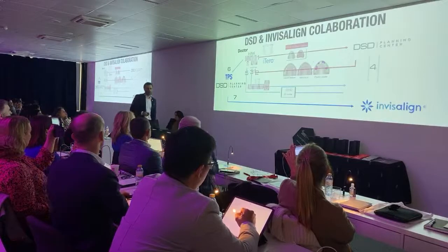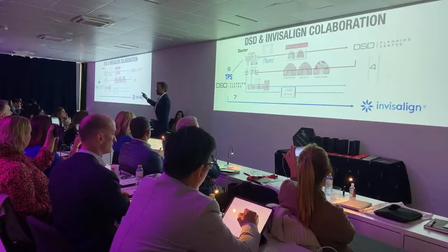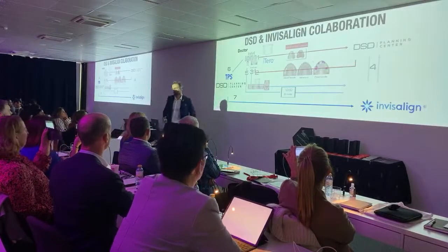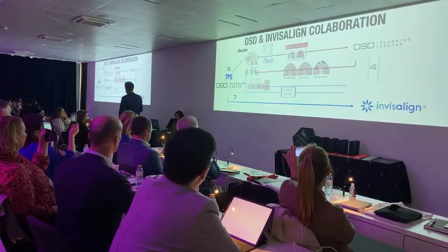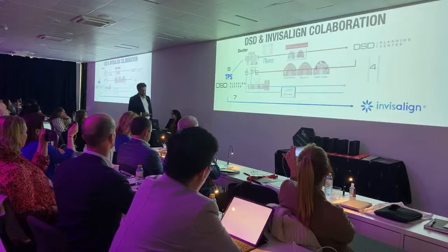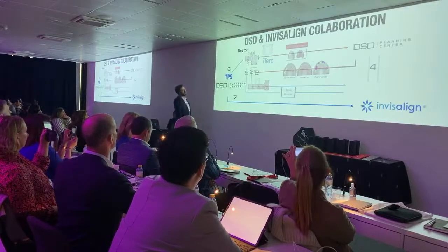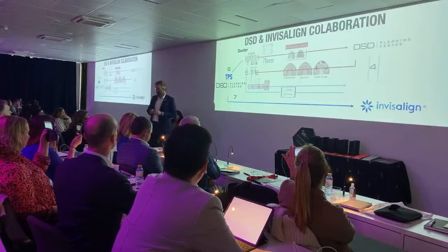But of course, you don't need to be that worried about that. The most important thing is to understand: if you have an issue and need help, customer support here will help you step by step. Okay? But then you have an option inside IDS to send to TPS. You are only allowed to have one TPS service inside your IDS.